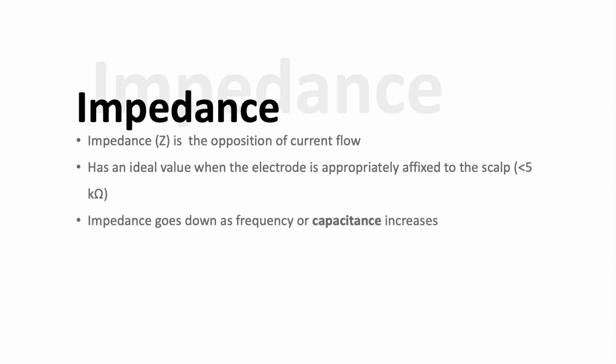If the contact between electrodes and electrolyte paste is inadequate, you may have an issue with impedance. Impedance is another important EEG biophysics concept. Impedance is summarized as how much opposition to AC current flow there is between two electrodes. If the electrode-electrolyte scalp interface is not correct at one electrode, the impedance will rise, leading to a high opposition of current at the electrode, which creates artifact. I'll expound upon this concept further in the artifact lecture.